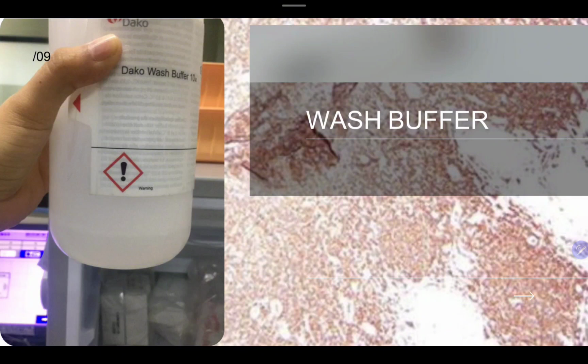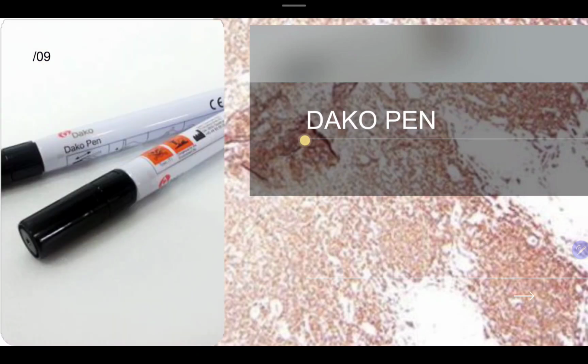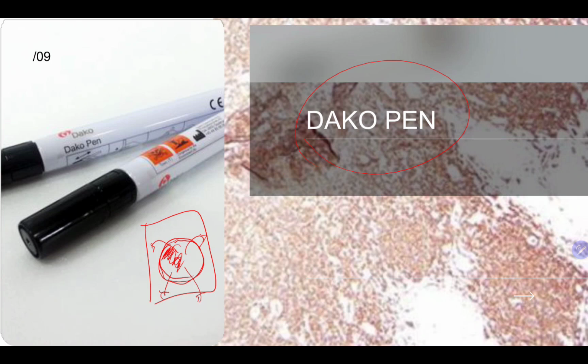Okay? So we also have mga wash buffer. Kaya dito po sa IHC guys, kadaming beses ninyo mag-wash. Promise. There is a proper procedure po talaga. Meron tayong Dako pen. Ang Dako pen po is ito yung glass slide. Kapag nagsulat ka diyan using Dako pen, tapos nagpatak ka ng tubig, the tubig will not go out. They will not leak out. They will avoid going out, because the ink ng pen natin is hydrophobic po siya. So ibig sabihin, the water will not go near sa ink ng pen natin. Hindi jud mag-leak ang specimen.